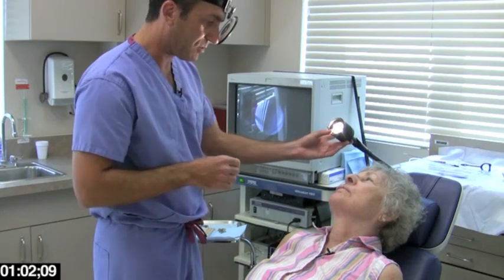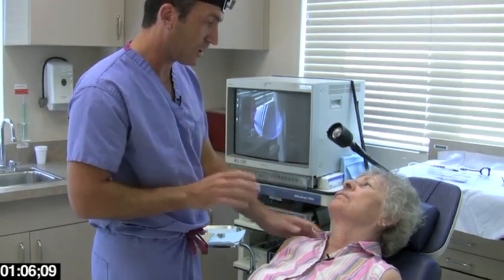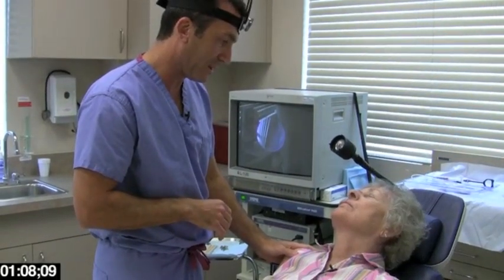Now that we have all this topical anesthetic sitting under your lip and in your nose, we're going to let this sit for about 10 to 15 minutes and then I'll be back.